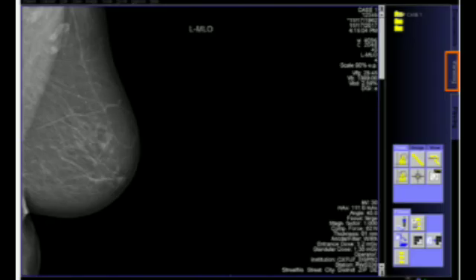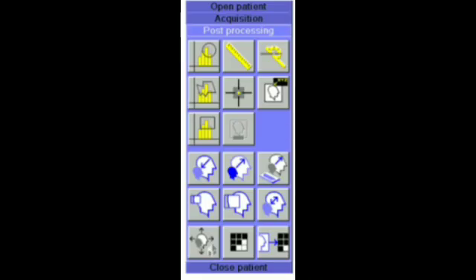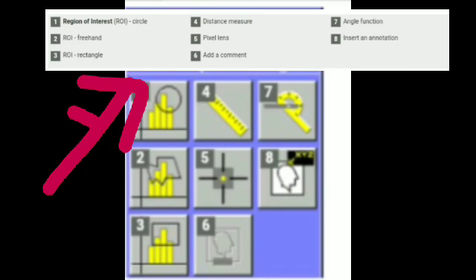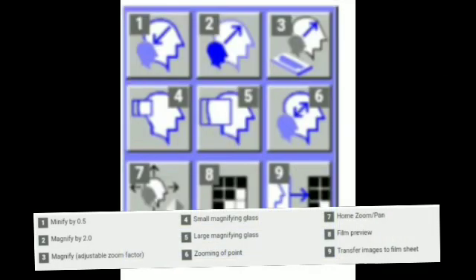Once this is completed, the post processing window will open automatically, and that is our viewing window. Our viewing window has various types of reconstructions; you can see the annotation angles, markers, magnifying, zooming, every option is there. This is how we can select multiple panels. Once all these things are complete, we have completed the post processing. Next we will go to the printing option.